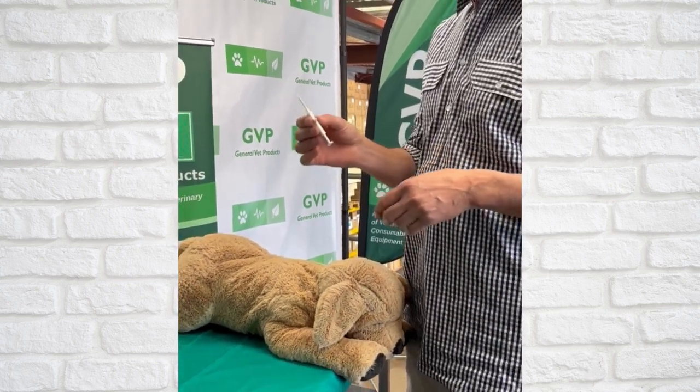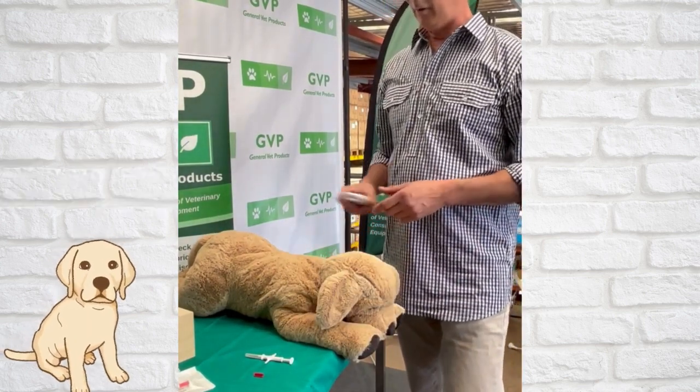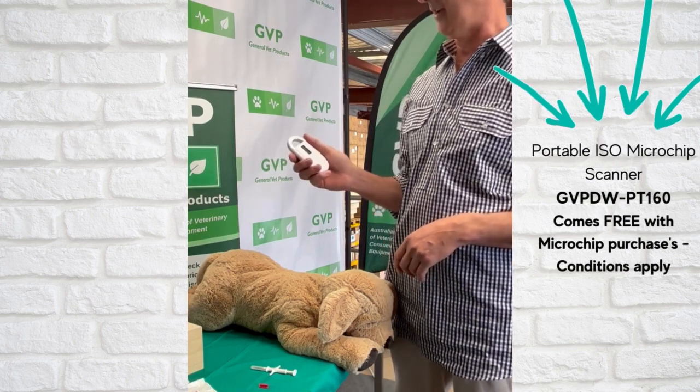So we're going to use this one here in a tick to microchip Margarita, but I also want to show you our most popular scanner as well.